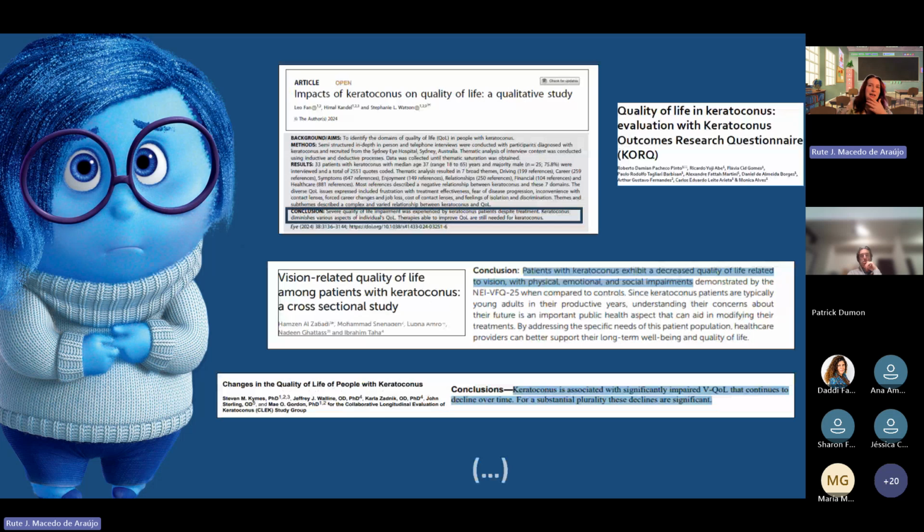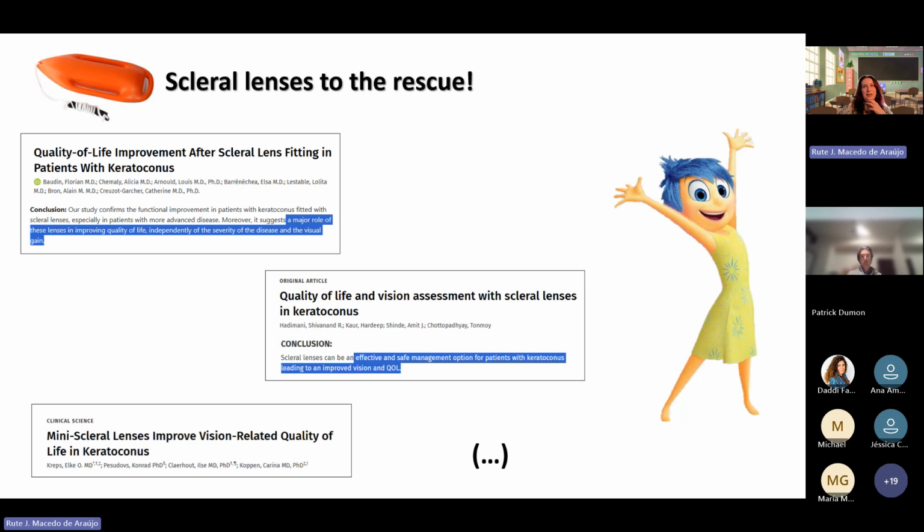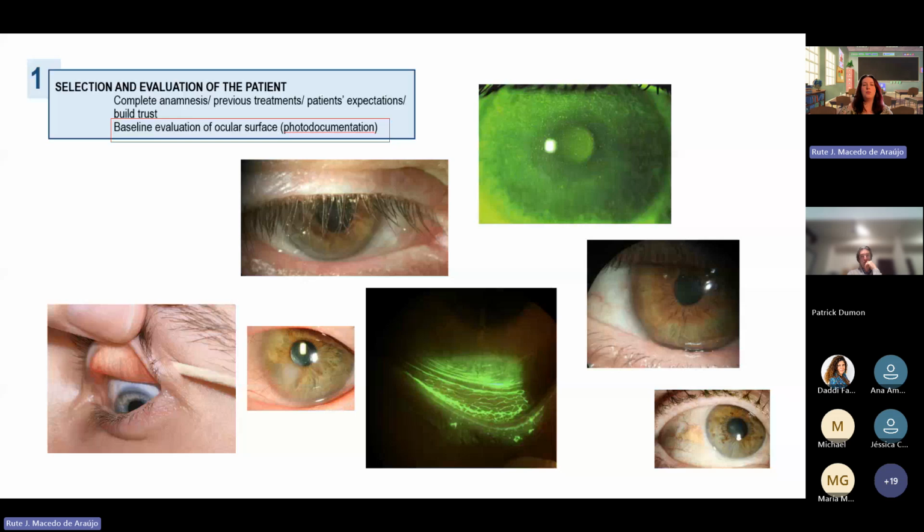Keratoconus has a big impact on the quality of life of the patients, not only on the quality of vision. From a different perspective, we can save their lives or their vision with scleral lenses, as many studies have shown that when we fit patients with keratoconus and other corneal irregularities with scleral lenses, we improve not only their quality of vision but also their quality of life. So moving on, we have done a complete analysis of the patient, showing empathy for this situation and building trust with the patient. Now we need to go to the more optometric things.